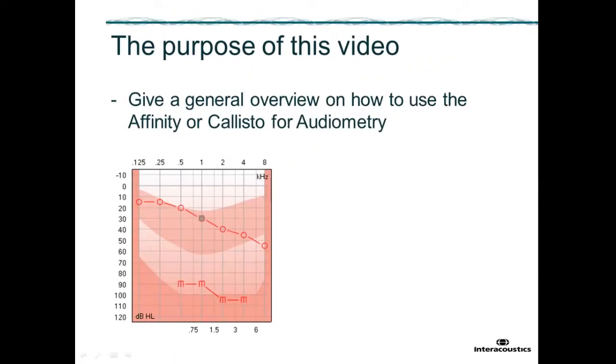This video has been created to educate on the basic controls and instructions required to perform audiometry on your Interacoustics equipment.